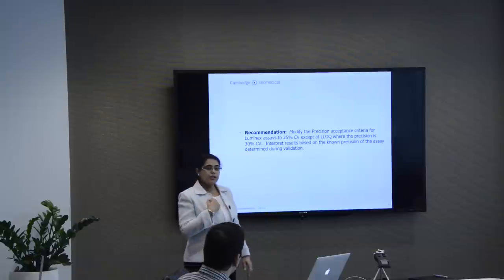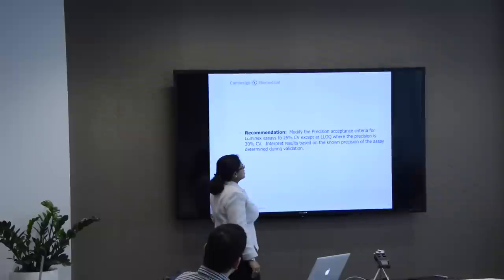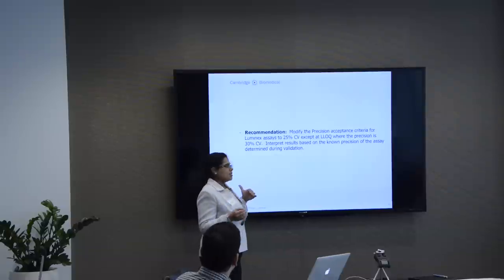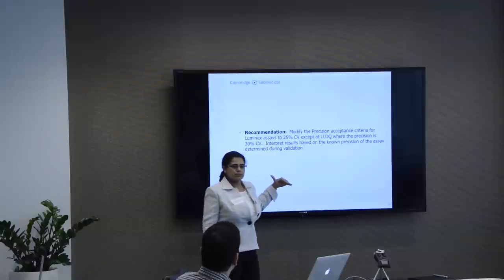So this is what we would like to recommend for Luminex assays, 25% and 30%. And when you are interpreting the results, you interpret them based on the known precision of the assay determined during validation.